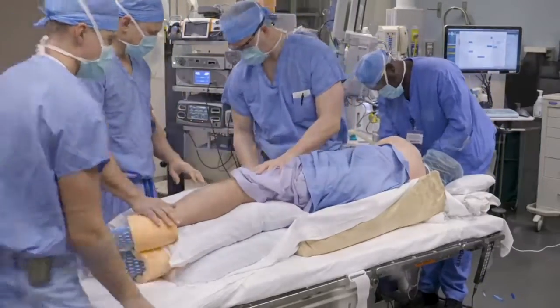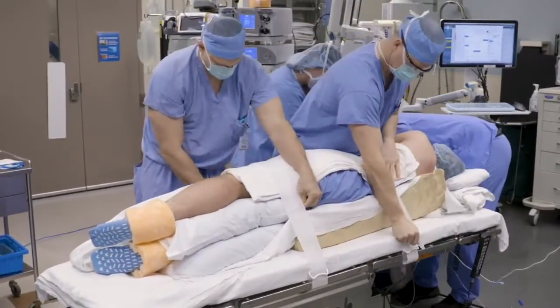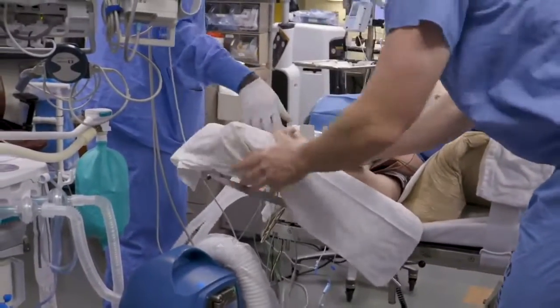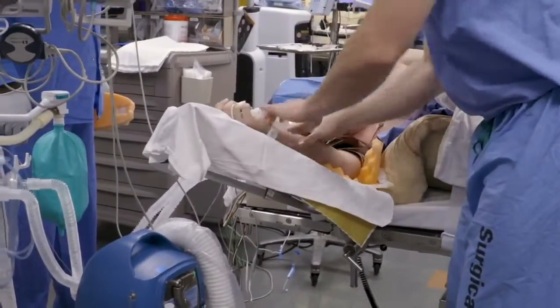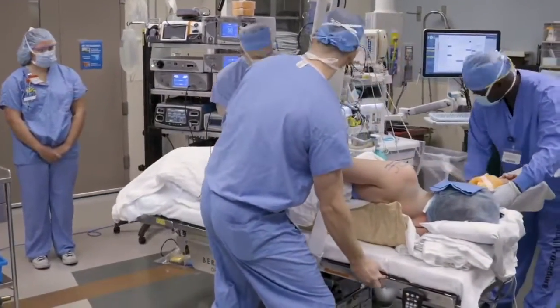The patient is then strapped to the table using one strap across the chest and one over the upper thighs. These are secured tightly, ensuring the chest strap does not obstruct the surgical field. On the opposite side of the table, the arm is secured with an articulating arm holder and the ulnar nerve and elbow are carefully padded. We take care to ensure anesthesia has appropriate access to the arm throughout the case. The patient is then rotated 90 degrees.